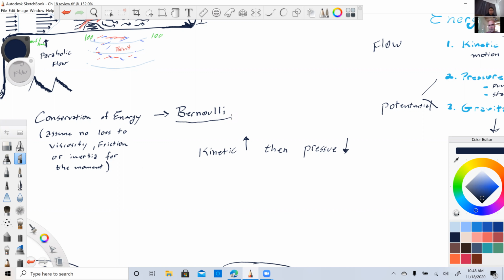And of course, Bernoulli has all sorts of effects. It has the bunny rabbit sign with the subclavian steal. It is the reason why I stopped doing simple color Doppler blood flow on kidneys, because it doesn't matter how much blood is going to a kidney if the kidney is under low pressure. Oh, by the way, the pressure never comes back. That's the other thing to remember.